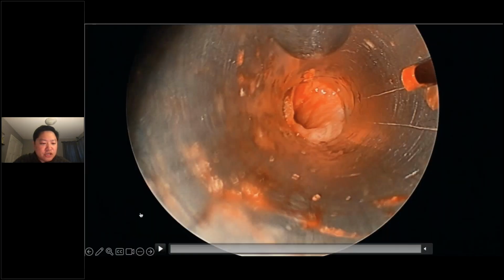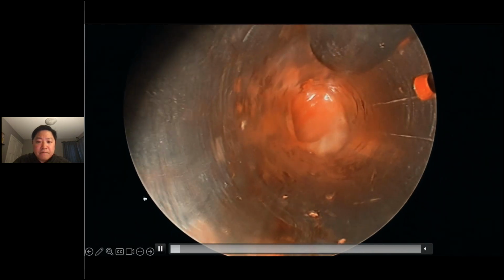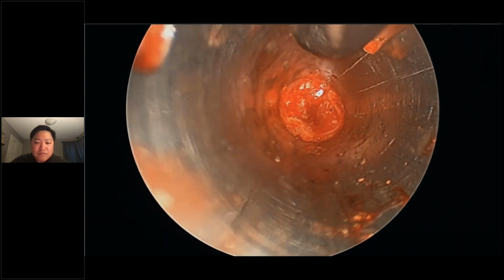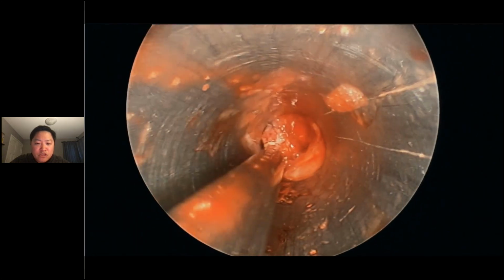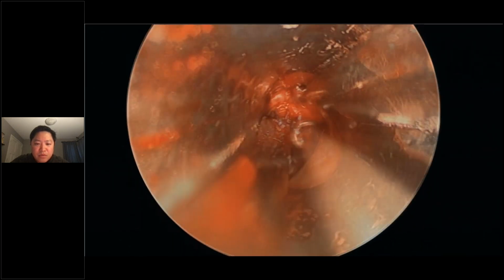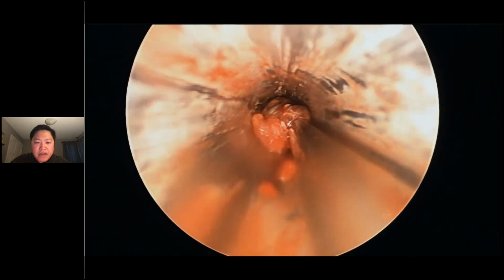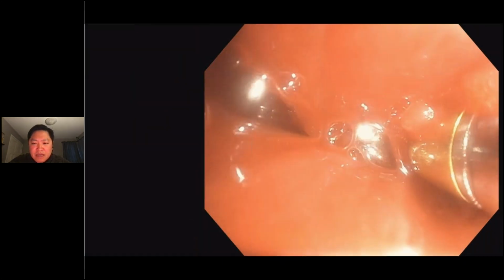So for this patient, I want to show you the video of what we did. I don't know if you remember, but it's a left upper lobe mass causing left main stem obstruction. We saw from the airway contrast images that in the left upper lobe there weren't distal patent airways, but there were patent airways in the lower lobe. So we decided to do the left main stem debulking.